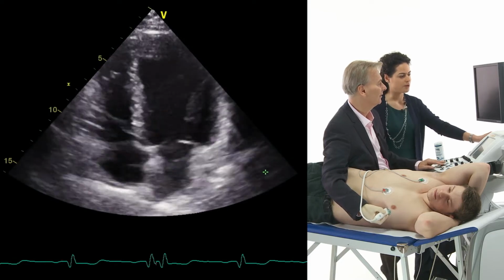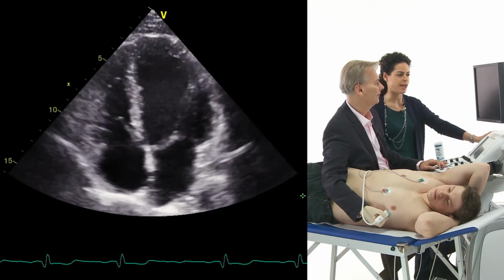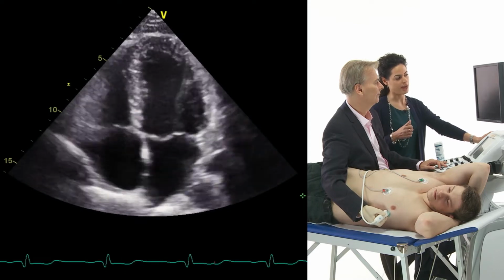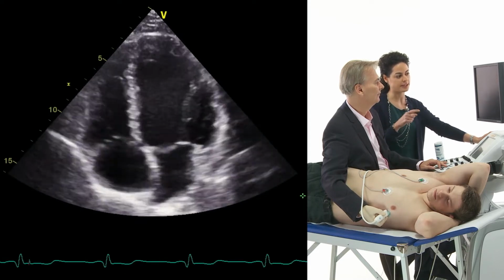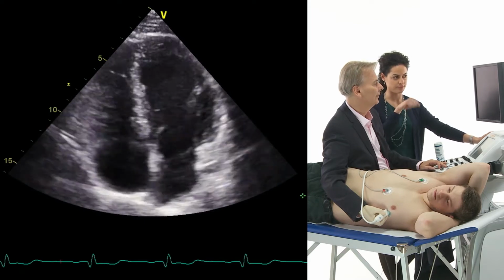Actually, what I really like to do in my patients when I analyze the mitral valve is, again, after performing the parasternal long axis view with the tilting, I do it again here. So I focus on the anterior part. Yeah, I'll show you this.